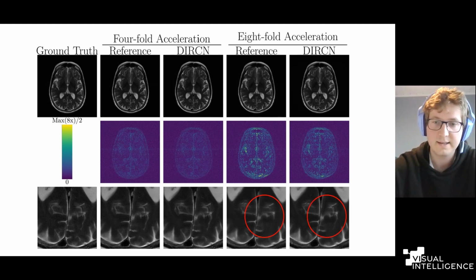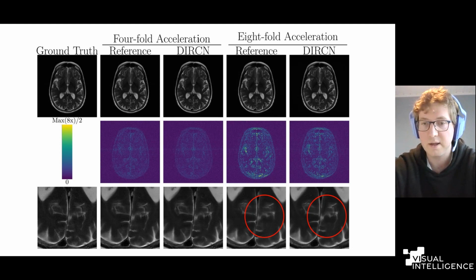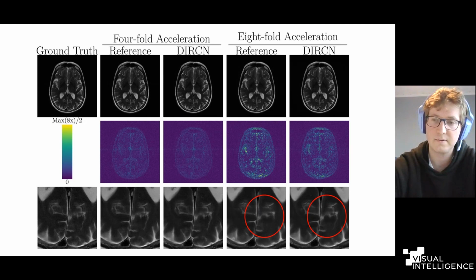And you can actually see it on the bottom right one, where the proposed one is slightly closer to the pathology. It should, of course, be mentioned that this is quite difficult to see if you try to look for it, because the reference models are really good in general.